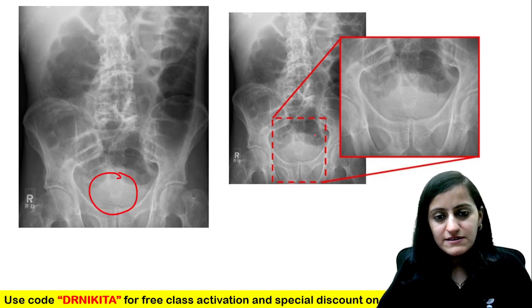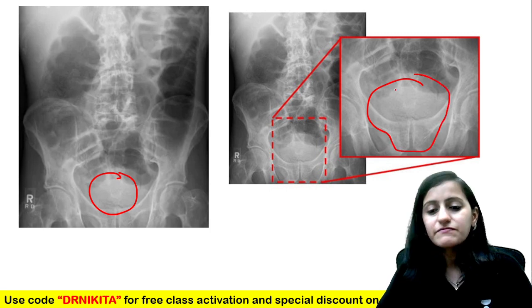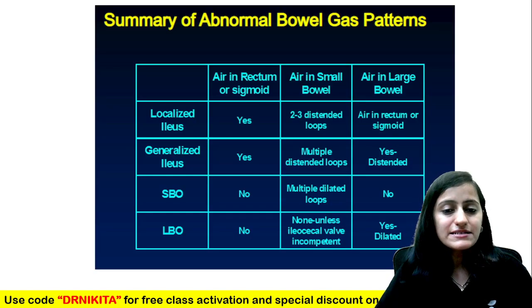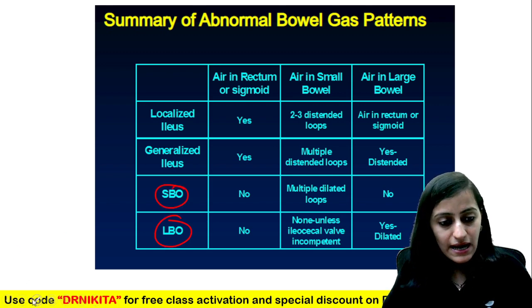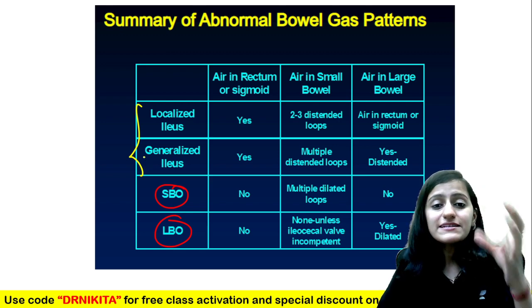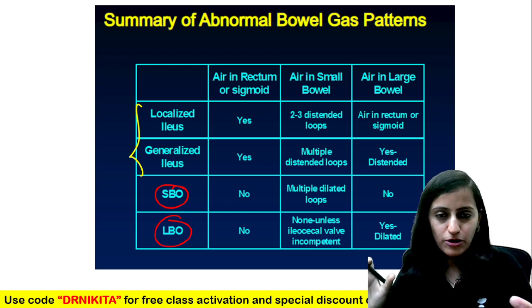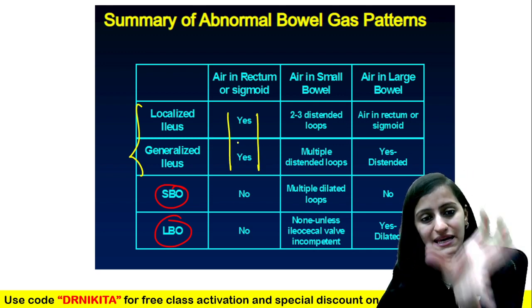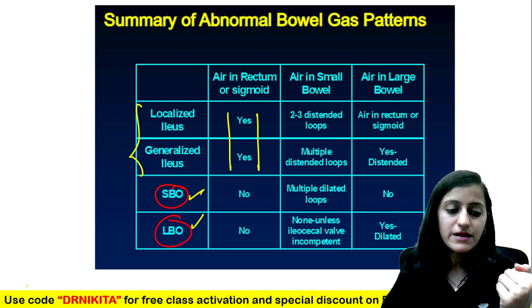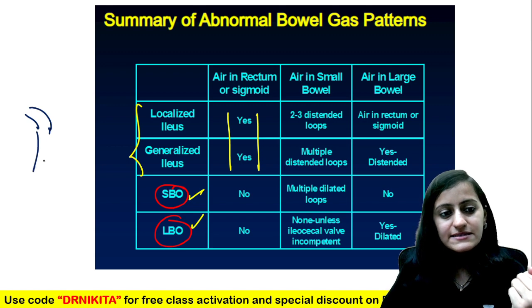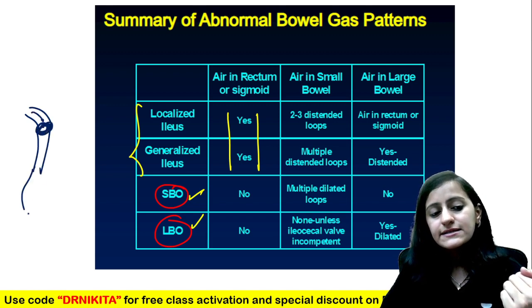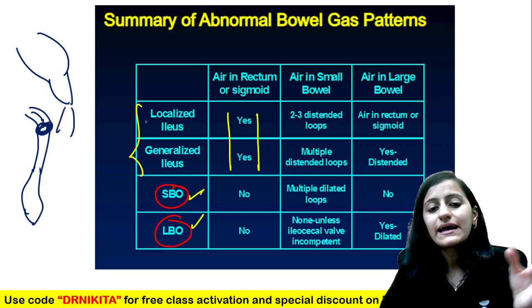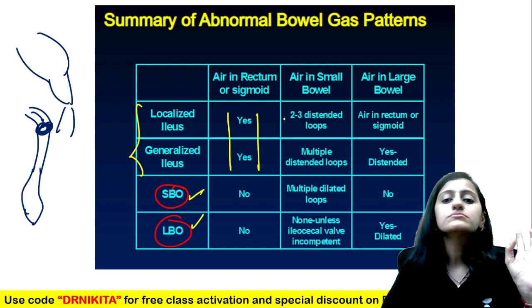In the magnified image of the same radiograph, we don't see air in the rectum — there is something impacting, which is the fecal impaction. For the summary of the abnormal bowel gas pattern: whenever it is ileus — a functional obstruction, not mechanical — air will be present in the rectum and sigmoid. When it is a mechanical obstruction, whether small bowel or large bowel, air in the rectum would be absent. If it is just functional obstruction (ileus), the air would go ahead and we would see it present in the rectum. This is how we differentiate ileus from obstruction.